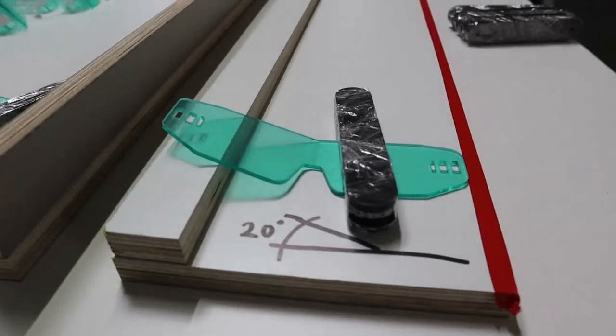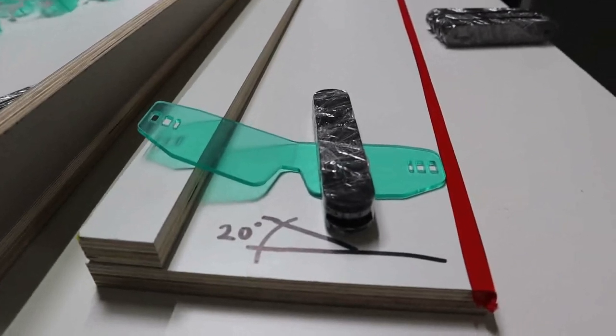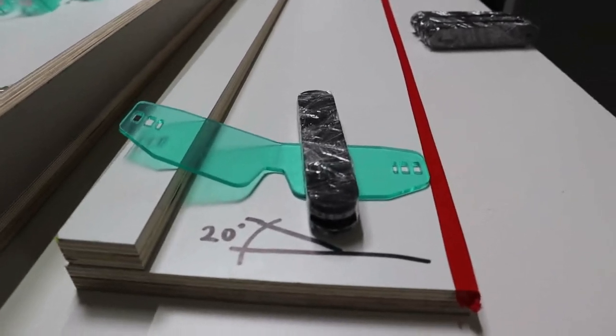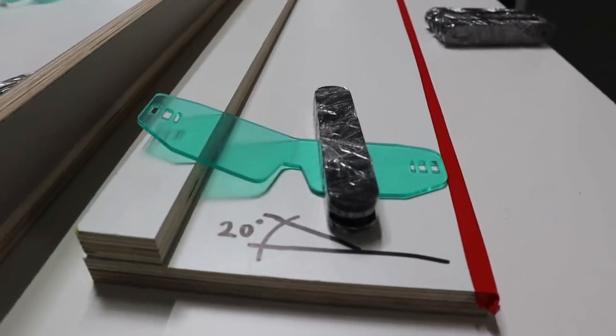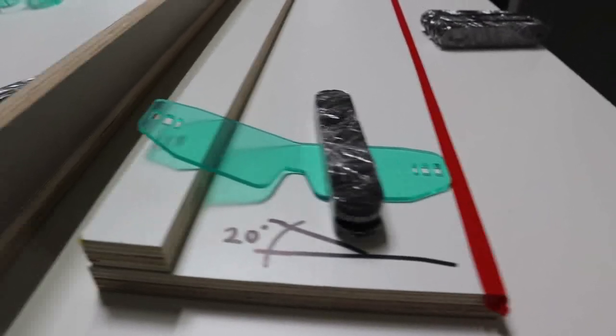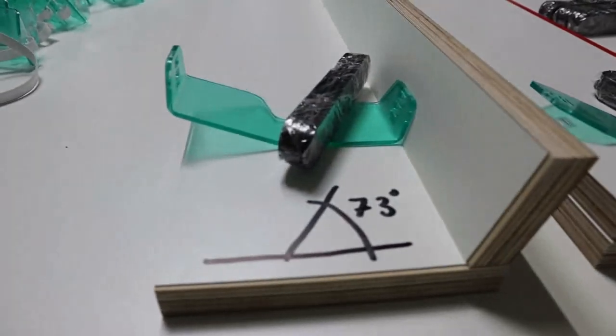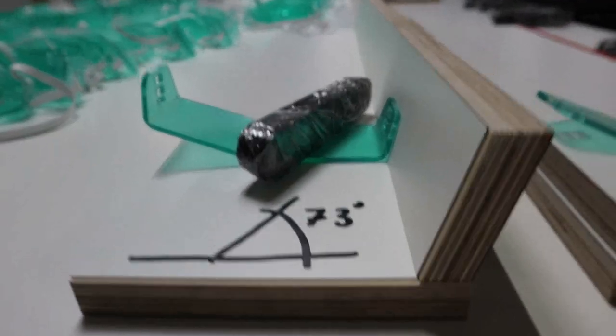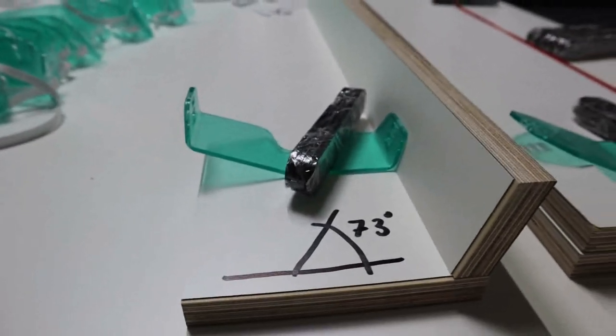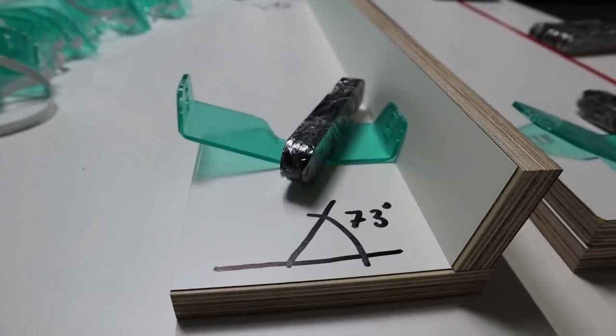To bend the glasses you only need two jigs. The first jig is nothing more than this, and it will bend the nose piece to 20 degrees. The second one is this—it's nothing more than this, and it will bend the sides to 73 degrees.